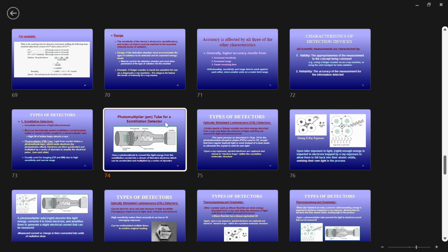Say he's in the room parallel to where you're at, you have to make an exposure when he tells you to, so that the machine can pick up if there's any radiation. Yeah, because he has to reset it each time. So he resets it. We make the exposure. He of course stands behind the barrier with us. And then when he goes outside of the room, we wait a couple seconds and make the exposure. He's able to measure it at each different point in the room. So then it's multiple exposures, and he's measuring from different areas. So they'll use something very much like this.